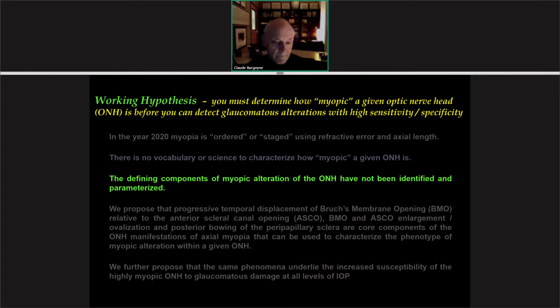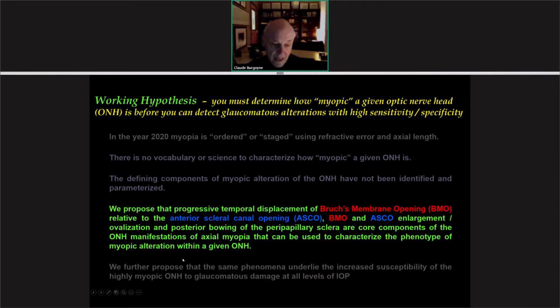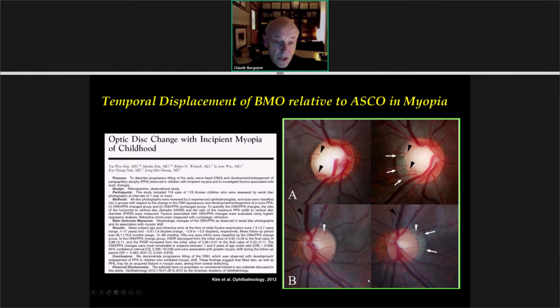We propose that progressive temporal displacement of Bruch's membrane opening — which I will refer to as BMO, delineated points shown in red — relative to the anterior scleral canal opening, referred to as ASCO, shown in blue, enlargement and ovalization of these openings, and posterior bowing of the peripapillary sclera are core components of the optic nerve head manifestations of axial myopia. These can be used to characterize the phenotype of myopic alteration within a given optic nerve head. We further propose that the same phenomena underlie the increased susceptibility of the highly myopic optic nerve head to glaucomatous damage at all levels of intraocular pressure.